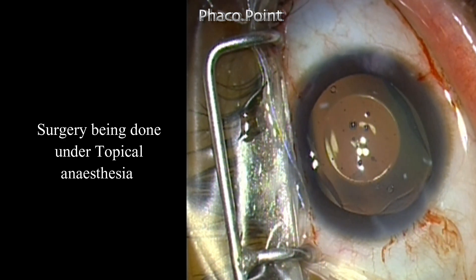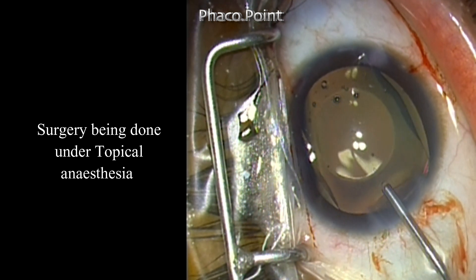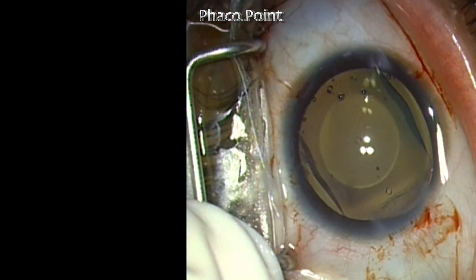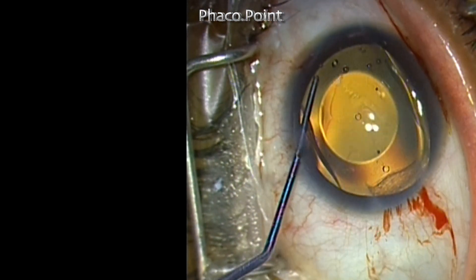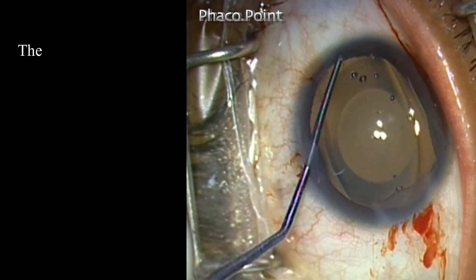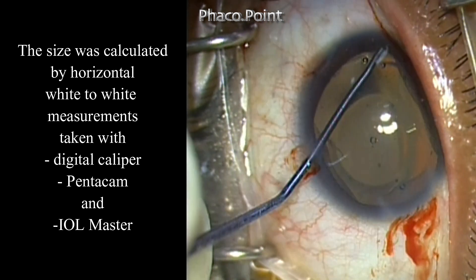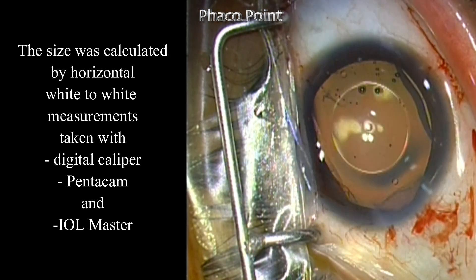I perform the procedure under topical anesthesia. Once it unfurls in the anterior chamber, I then take care to tuck each of the four portions of the haptic behind the iris. The size was calculated by horizontal white-to-white measurement taken by digital calipers, Pentacam, as well as the IOL Master.